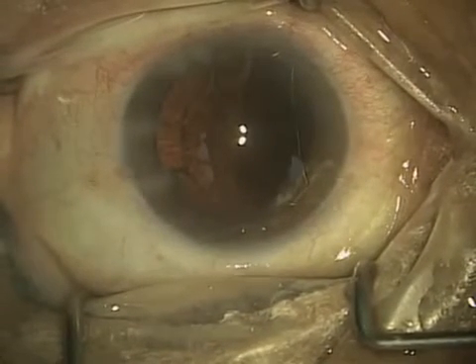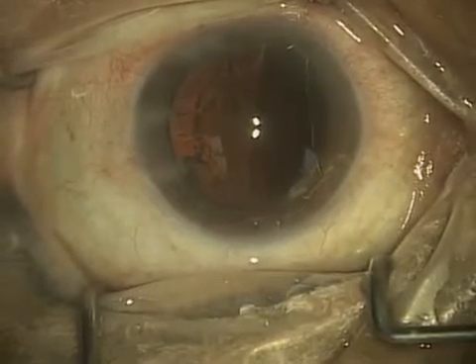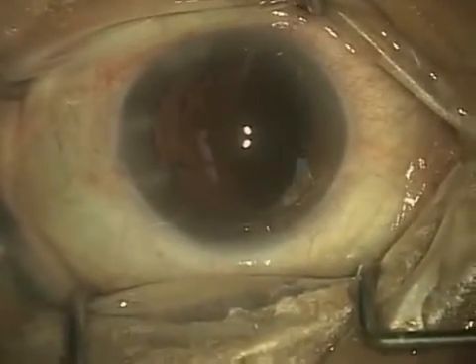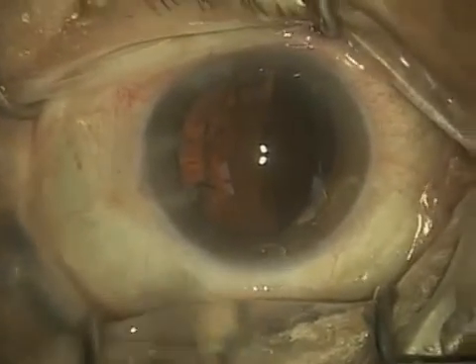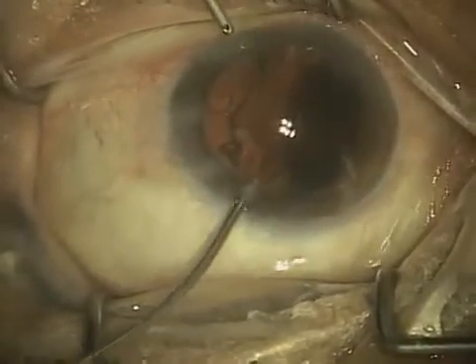I use what's called a bimanual irrigation and aspiration set. Not everybody uses bimanual, and later you'll see what is more typically used, which is called coaxial, but I find that the bimanual gives me a lot better control over the removal of this cortical material.